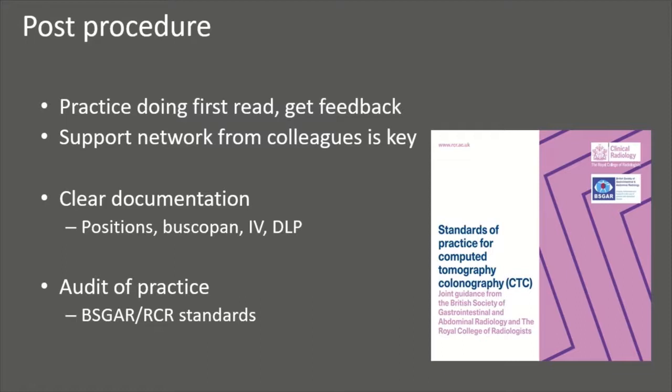You need to clearly document various areas such as patient position, was Buscopan used, was intravenous contrast used, and what was the dose. And that all comes down to my final point in regards to audit of practice. Very recently, the British Society of Gastrointestinal and Abdominal Radiology and the Royal College of Radiologists have jointly produced some standards with regards to CTC.